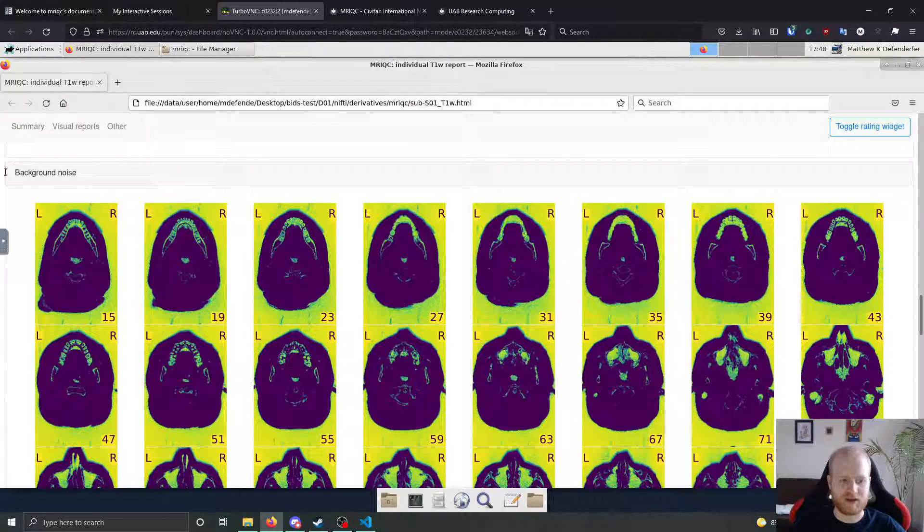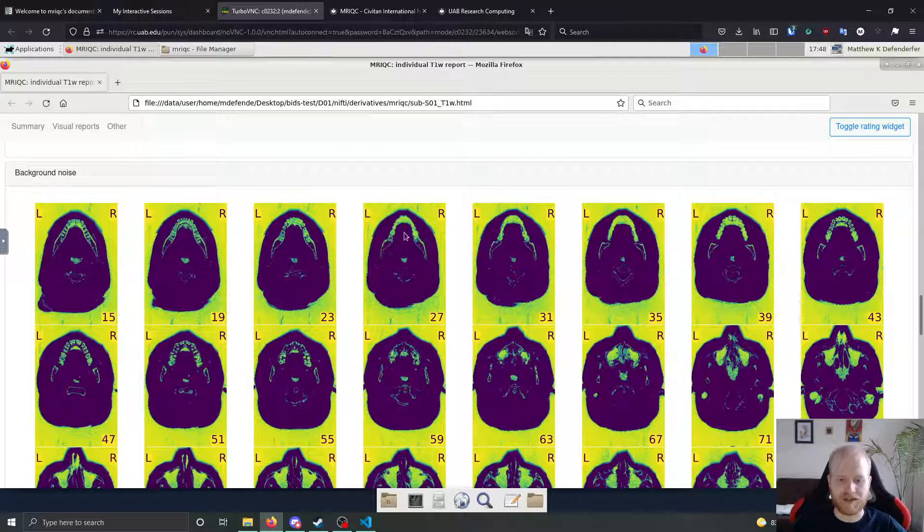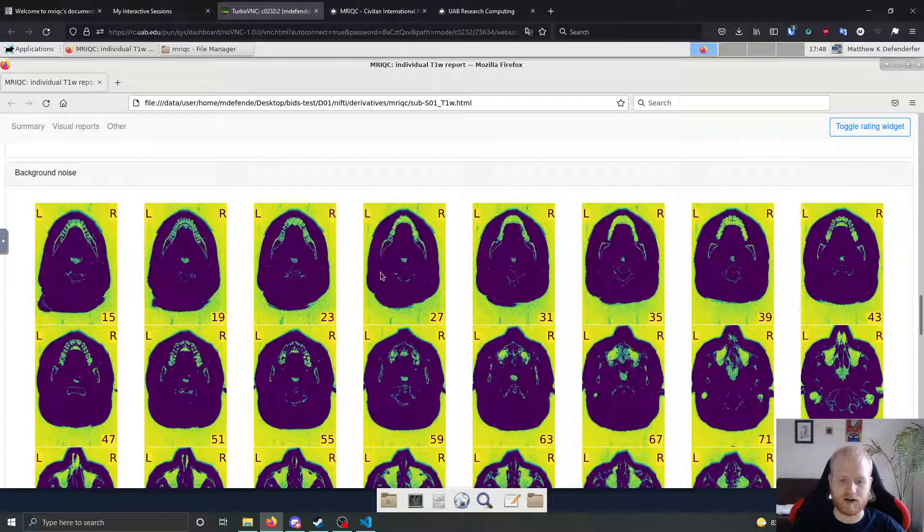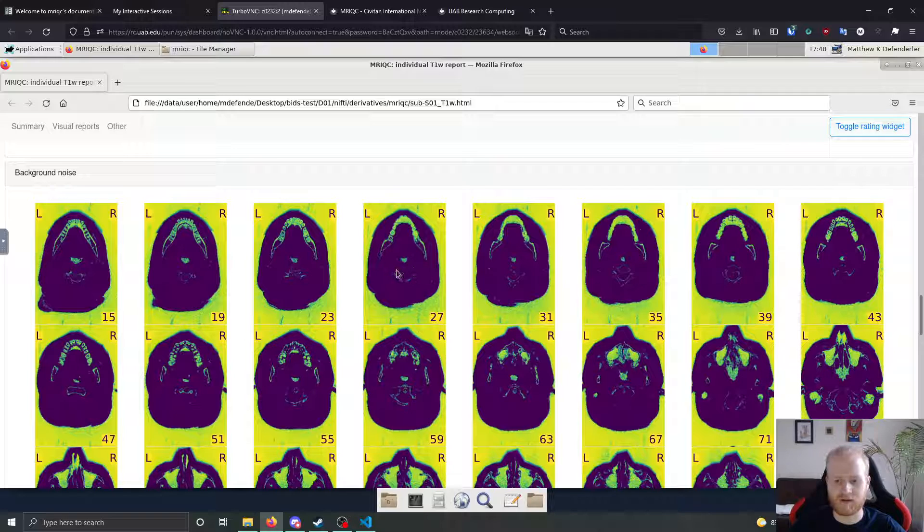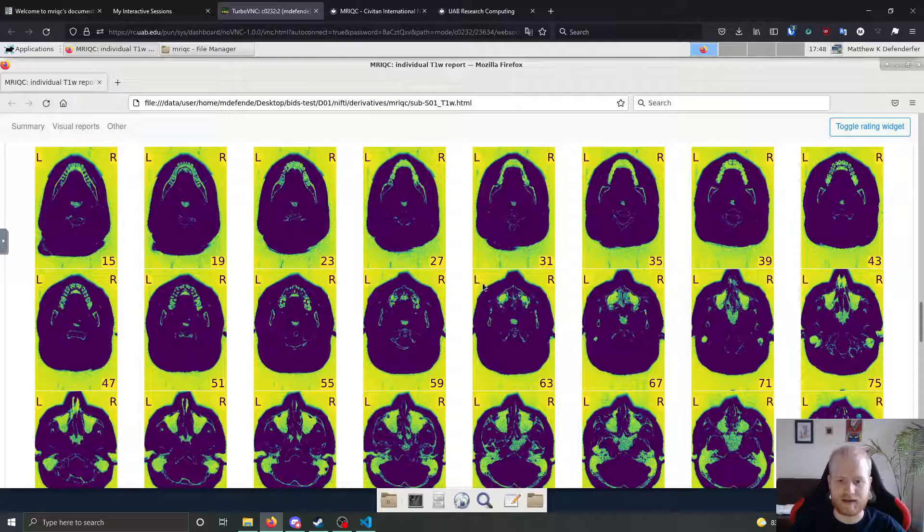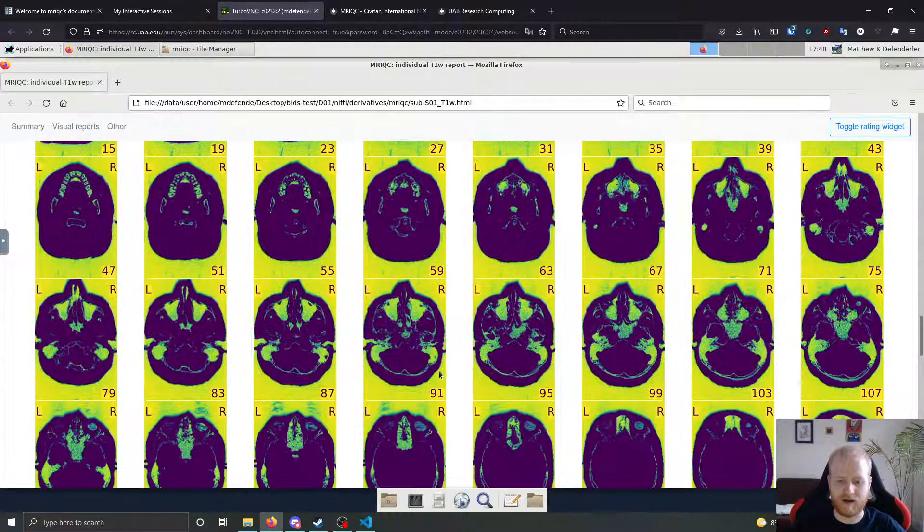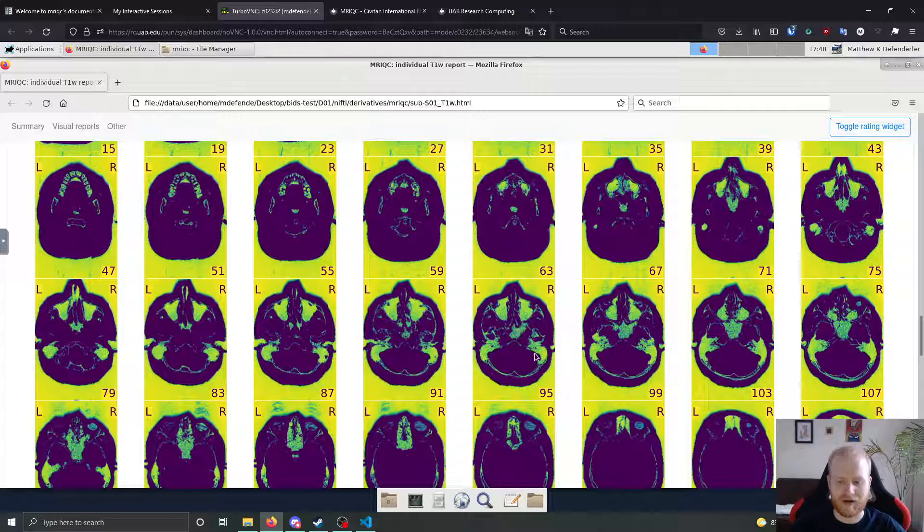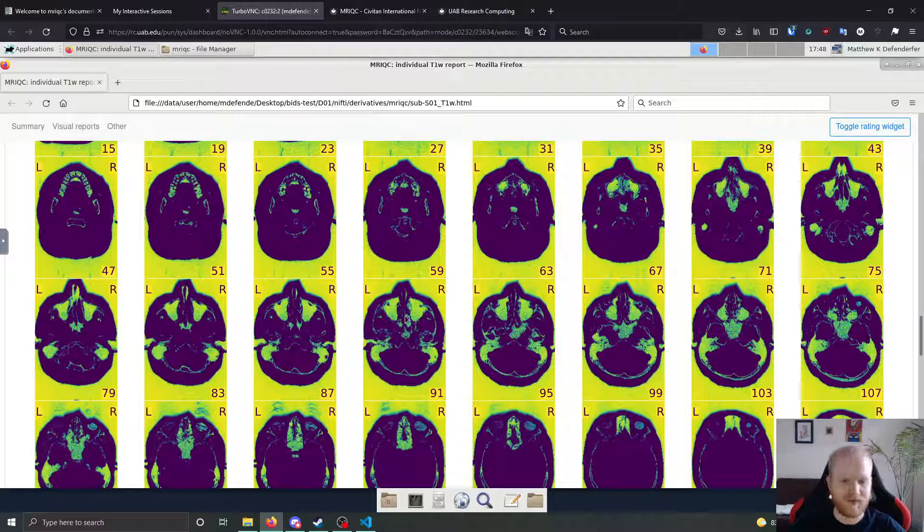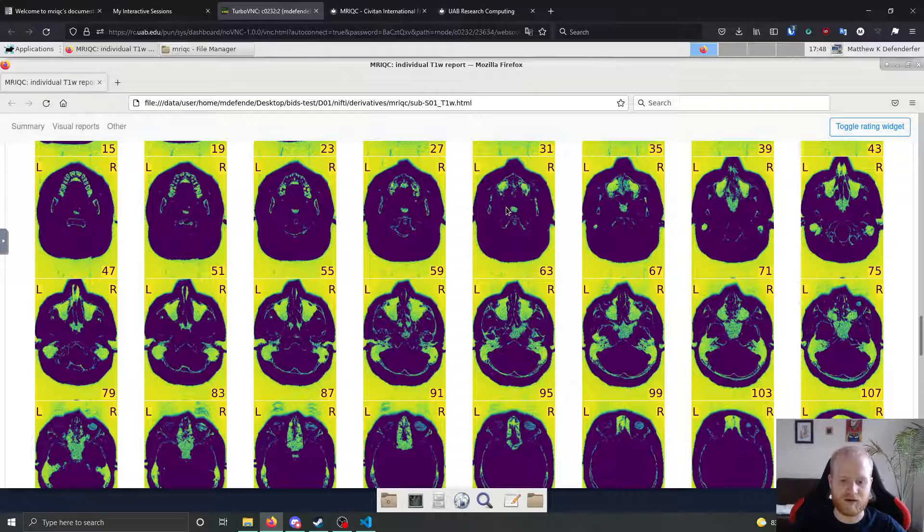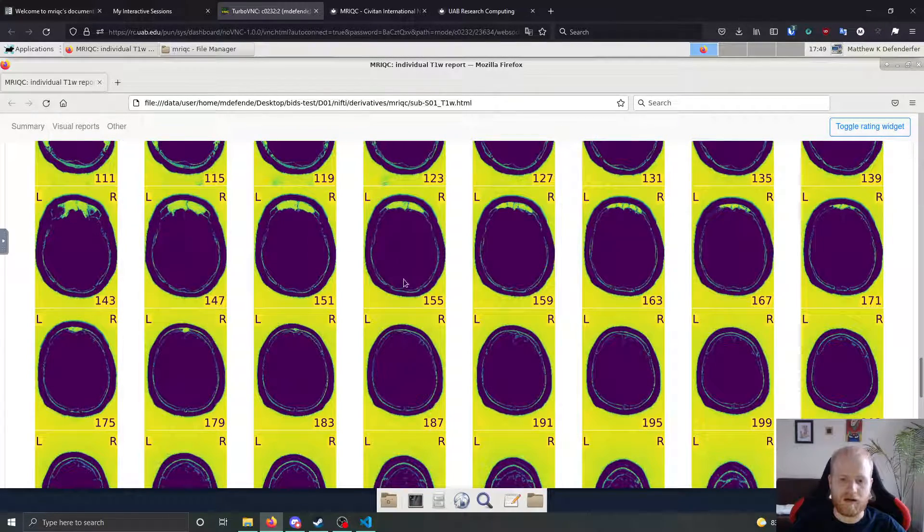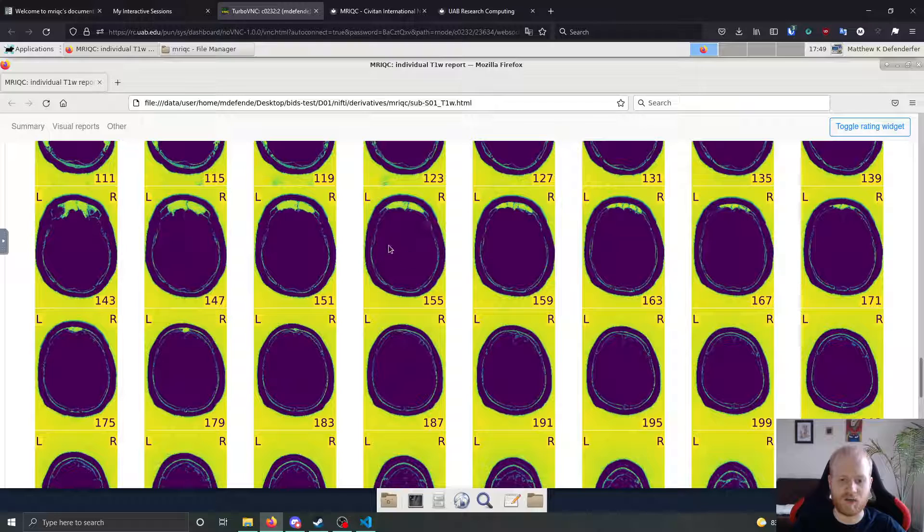As well, another visual output is going to be background noise. So you can scroll through and see that yellow and green are going to be areas of high background noise, whereas areas of dark purple are going to be areas of low background noise. And what you want, if you look through, you can see that the teeth, things like the teeth and the sinus cavities and ear canals and things like that, various anatomical features are going to have high background noise.